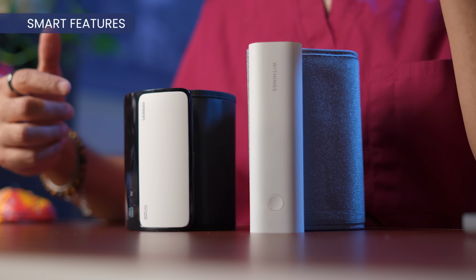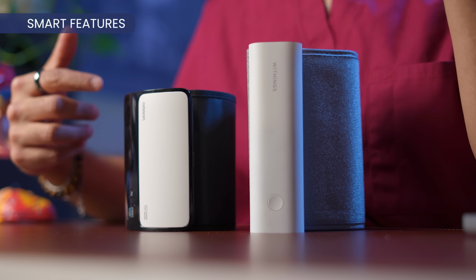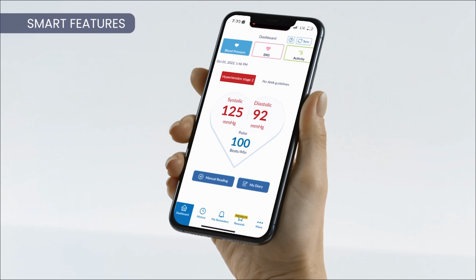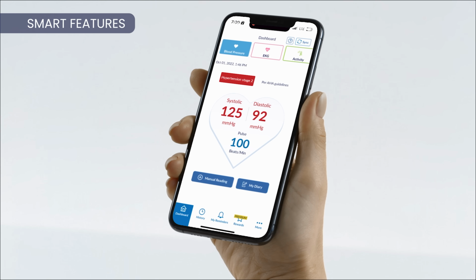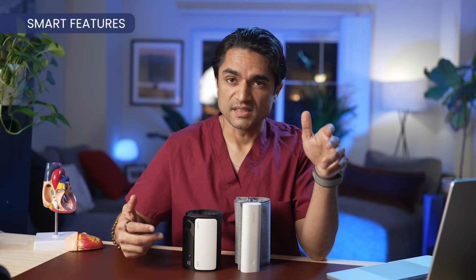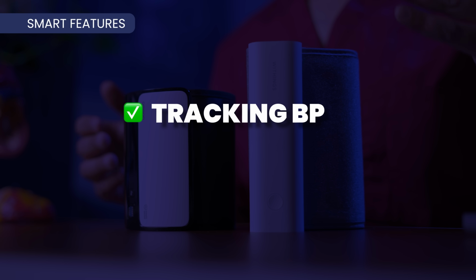The Omron Evolv just stores the readings in the machine and downloads them to your phone each time it connects. The Evolv supports up to 2 users compared to the Withings 8. Unlike the Withings machine, the Evolv has to connect to your phone every time, so you can switch the active user in the app when you connect it, but the last person to use it needs to download their readings to their phone first.